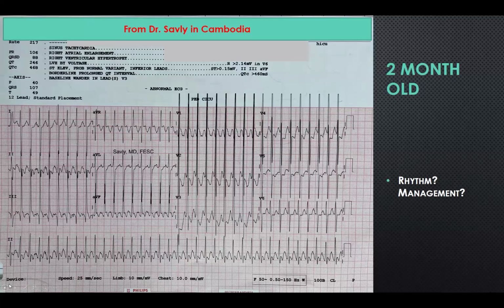It's very, very important, and this is an error that I've seen done a few times, which is that people generally are afraid to give a lot of energy. I mean, it's understandable. It kind of goes against the nature as a human being to shock any other human being, and so the last thing we want to do is give too much. But remember always, when you're talking about a ventricular arrhythmia, 2 joules per kilo is the starting dose, and atrial is a half to 1.